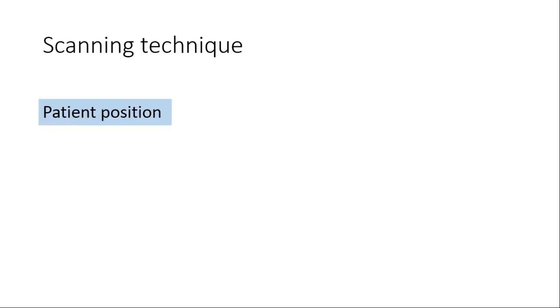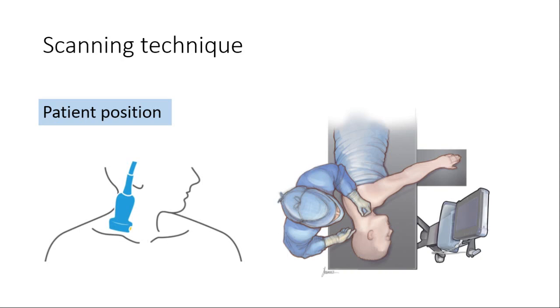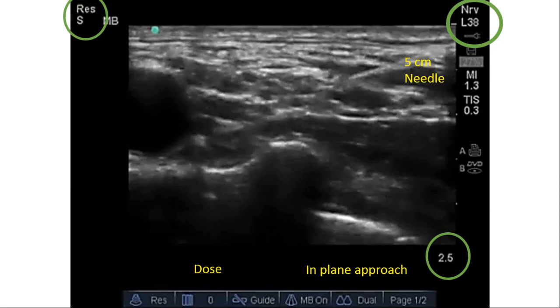The scanning technique can be performed with the patient supine with head elevated and turned to the opposite side, or in the lateral position. In both positions, the operator lies on the same side and the machine is on the opposite side. When we put the probe on the supraclavicular fossa targeting the thoracic inlet, we will see this picture.